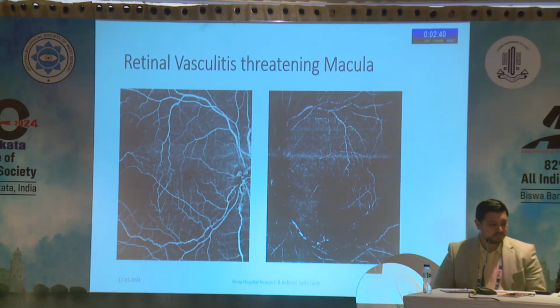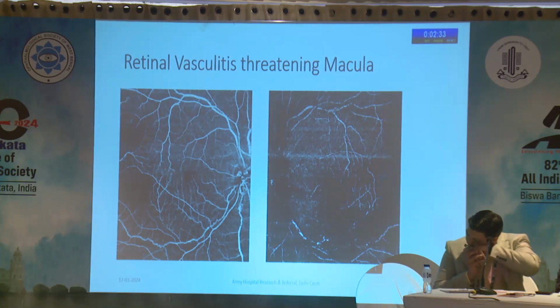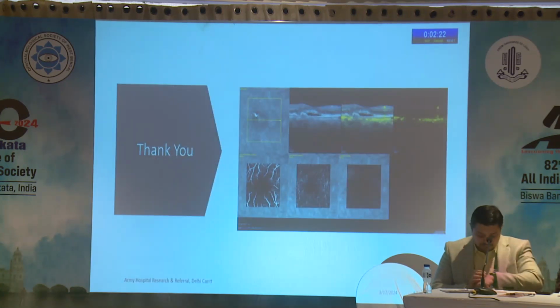So he has lost a certain amount of field and continues to be on immunosuppression. So this kind of information, when you do not have a firm belief about why to do an angiography in this patient, let me just do an OPD procedure, 1 minute click, and you have a diagnosis in front of you, and it gives you a treatment option. Thank you so much.